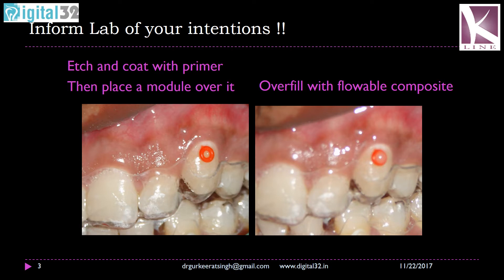The first thing you have to do when you are going to intrude or extrude any teeth is that you need to communicate your intention to the lab. It is very important that K-line knows what you're planning so they can create space within the aligner for this movement. The first step involves etching of the tooth — you clean the area where you want to fabricate a button. Once you have etched that area, you apply a coat of primer on top of it, then place a small module — the same module that you use around brackets. Light cure the primer with the module for 10 seconds.